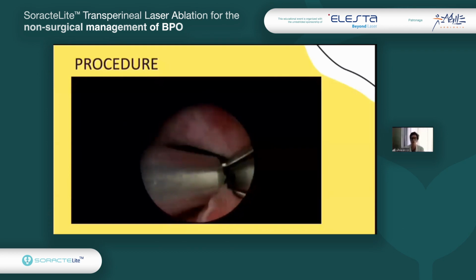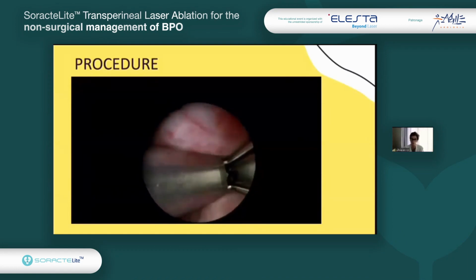After 2 Urolift implants, it is advisable to repeat a cystoscopy to see if there is still any obstruction and eventually to decide where to put the other devices. Let me say something about the position.